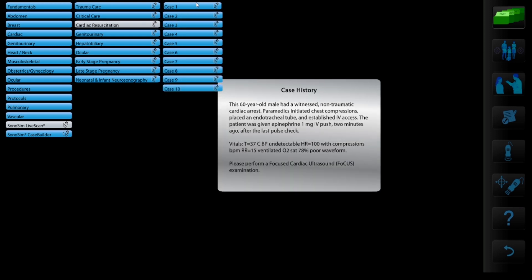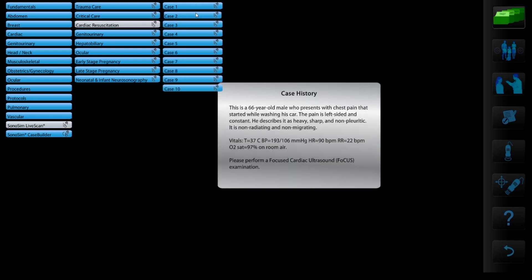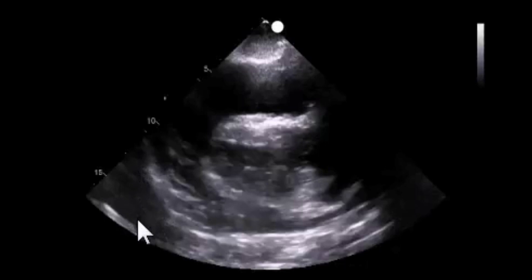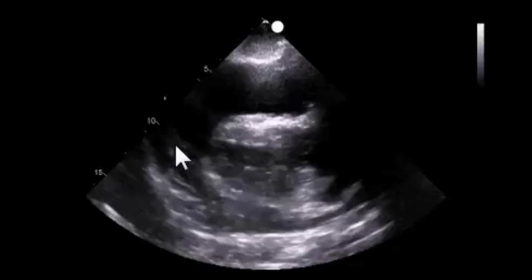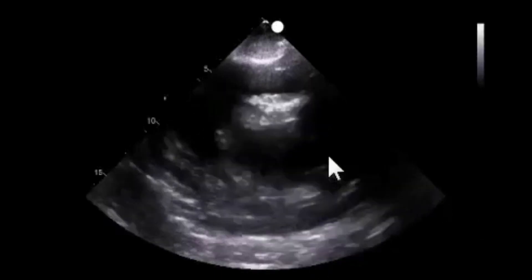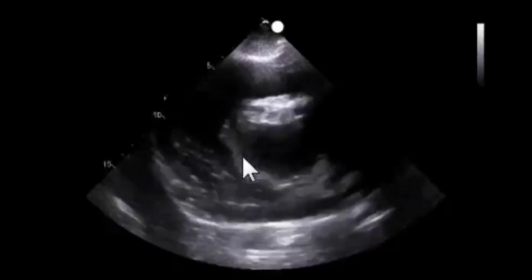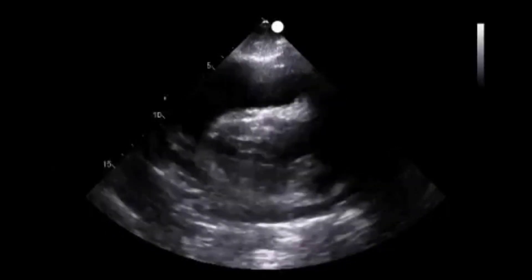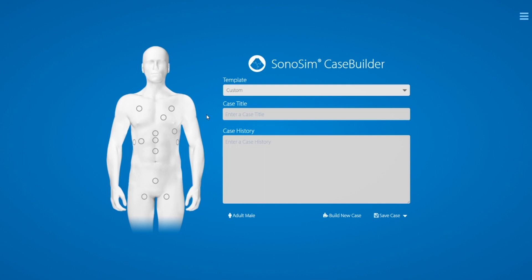Each case has a patient history, as well as videos describing each ultrasound window in detail. We can see a large pericardial effusion, and diastolic right ventricular collapse — notice what's happening to the apex of the heart, it is moving everywhere. This is a swinging heart. If you don't find a pre-built case that meets your training needs, you can create your own using SonaSim Case Builder.